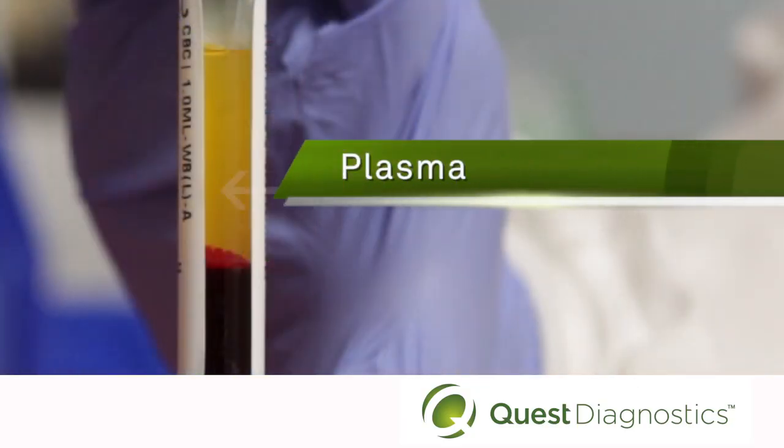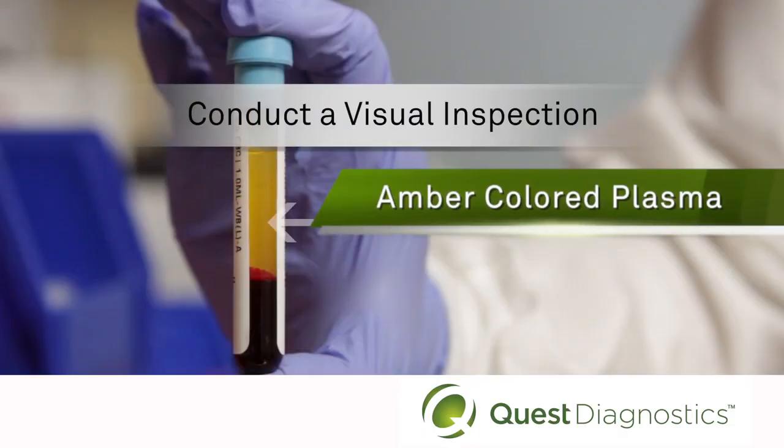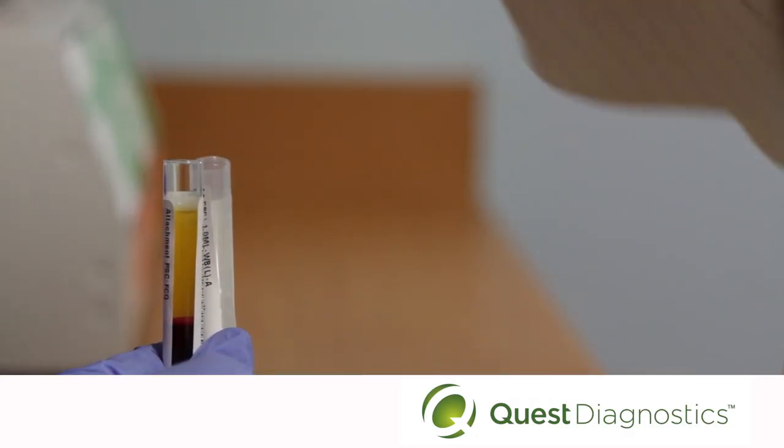These layers are the plasma, the buffy coat, and the cell layer. The plasma layer should be amber in color. If the plasma appears red-tinged instead of amber, your specimen is hemolyzed and will require recollection. Your next step is to remove the plasma layer, being very careful not to disturb the buffy coat layer or cell layer.